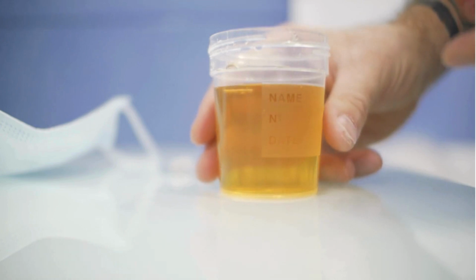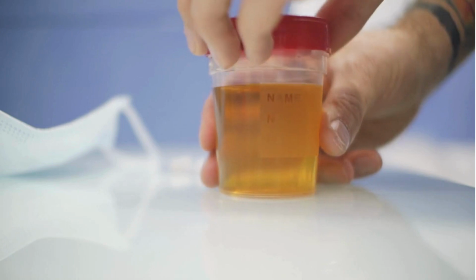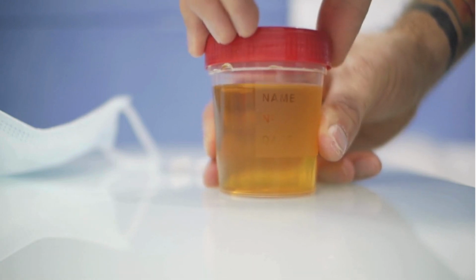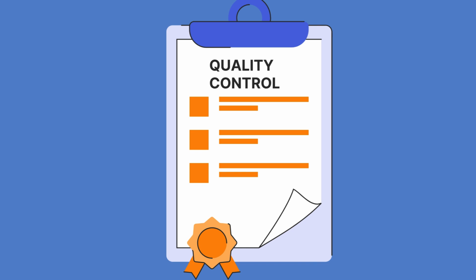In this video, I'll be instructing two methods of urine specimen collection, which are the midstream clean catch urine sample and a random urine sample as well. Before going ahead with our urine analysis and checking for the chemicals, we should go ahead and do a quality control test when testing urine with reagent strips. Quality control testing ensures the reliability of test results by, one, determining whether the reagent strips are reacting properly, and two, confirming that the test is being properly performed and accurately interpreted.